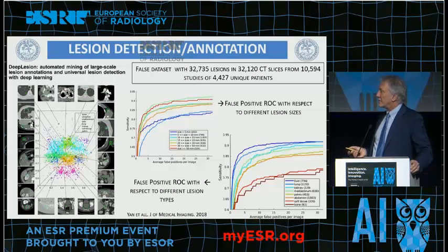And this is a very interesting paper from NIH. It shows that you can detect lesions. The liver is probably the best detected. Lesions in the liver are very well detected with this system, while for soft tissue and bone lesions this algorithm has very poor performance.